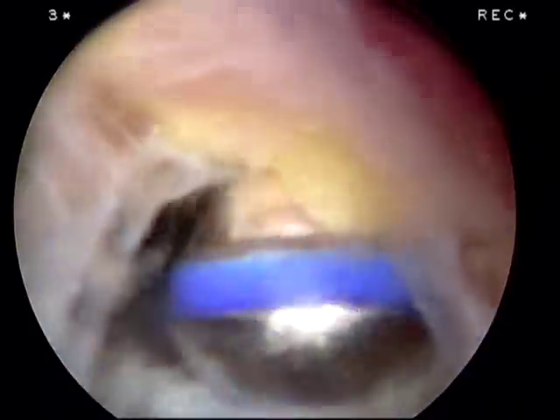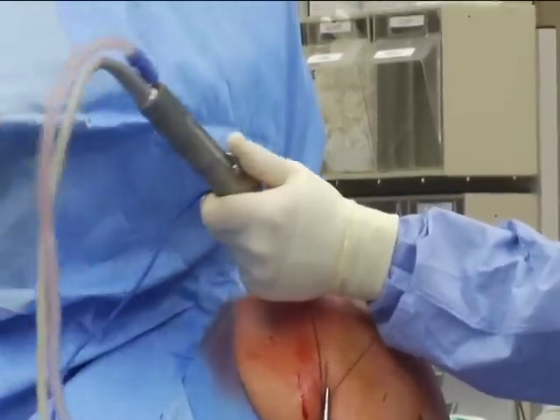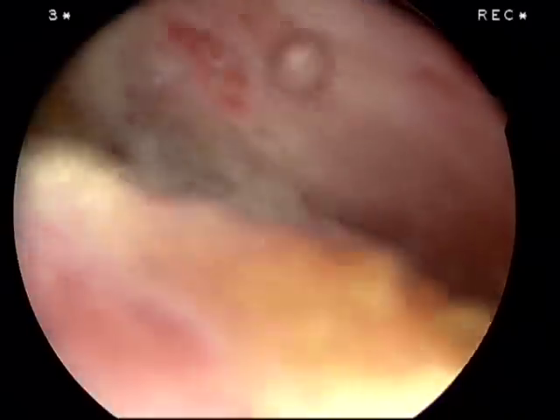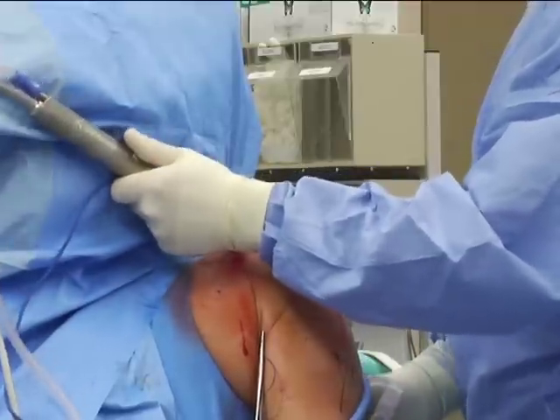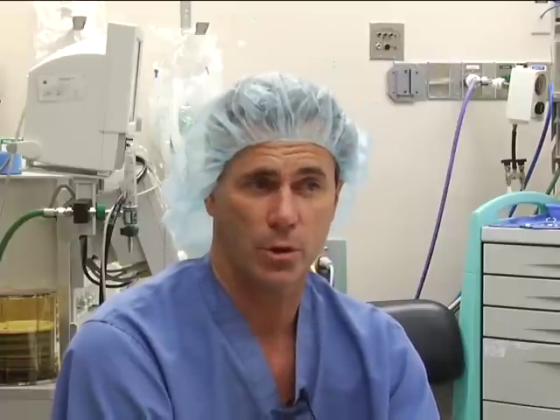I don't want the blades to hurt the cuff, and that's also the only side that cauterizes — the blade side — so it also protects it from cautery. Once I get a little started and I'm on the acromion, that's when I go one direction and run cautery as I outline the acromion. It significantly decreases the amount of bleeding while you're shaving. And if you happen to hit a bigger bleeder, you can just stop shaving and go right over and coagulate it.